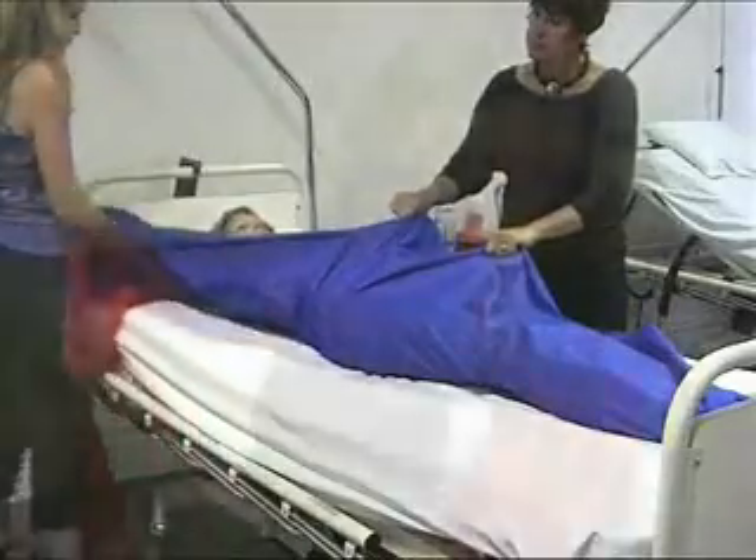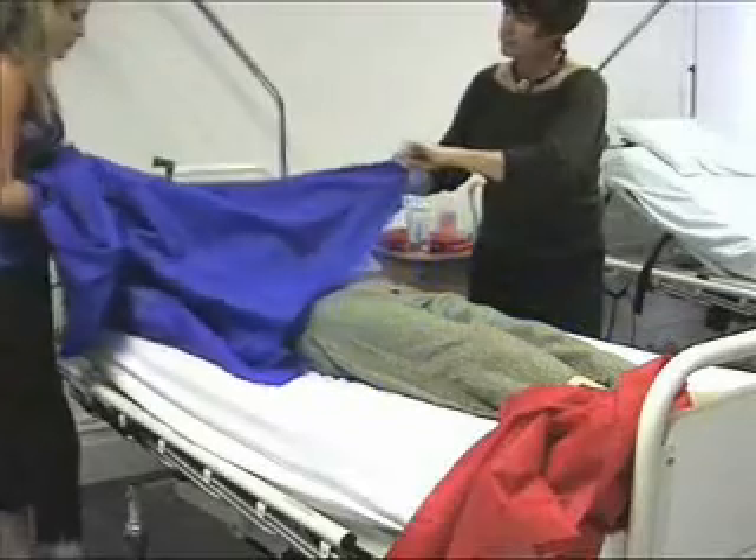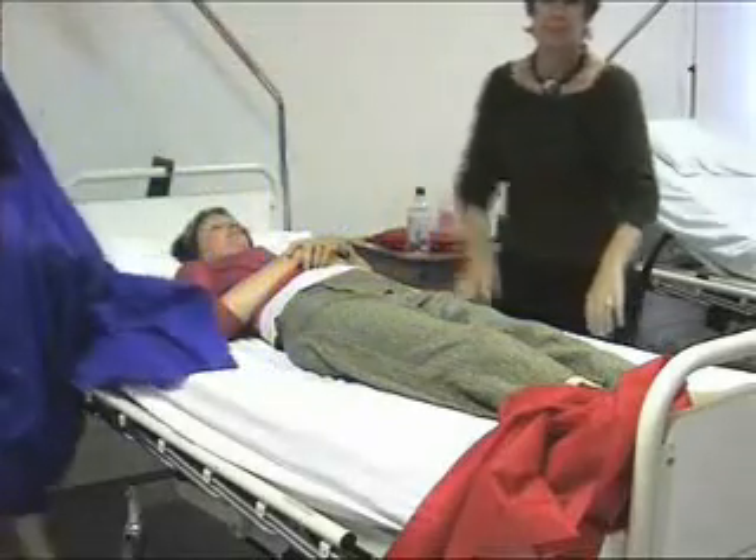Then remove the top sheet. The patient is still in the same position up the bed, and you have not needed to roll them to remove the slide sheets.